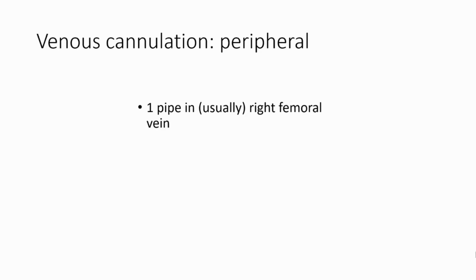And sometimes when opening, you can have a situation where the right ventricle is essentially stuck to the bottom of the sternum. And sometimes the surgeons may be concerned that when opening, they may damage the heart or damage an important structure. So they will, in advance of that, implement a peripheral cannulation strategy so that if anything happens, they can go on bypass, or sometimes they'll just go on bypass anyway before opening the chest.